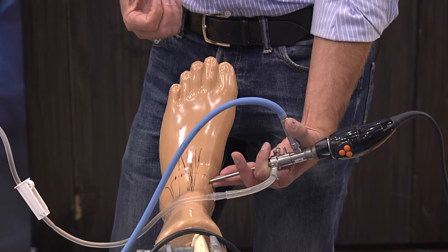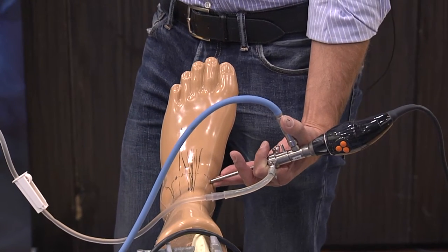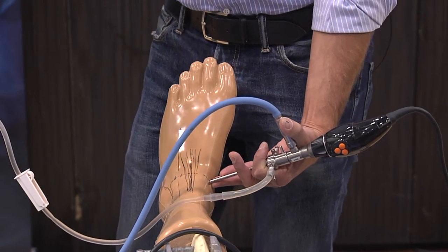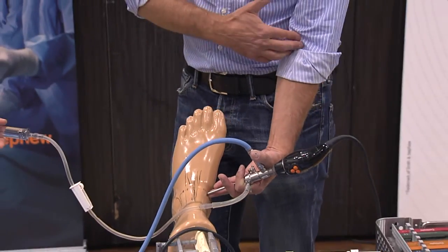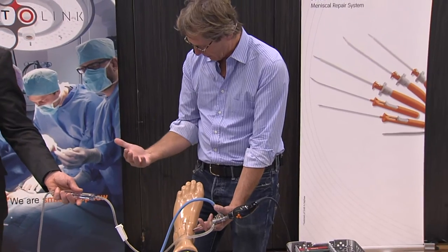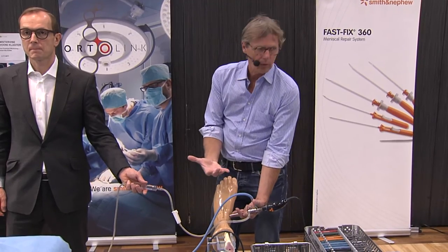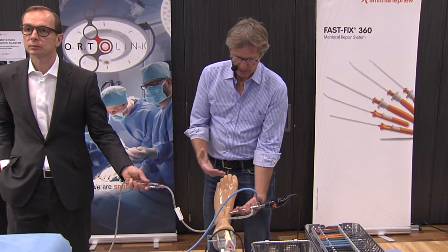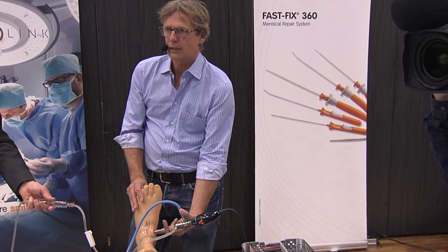In the courses I give, participants say their hands are too small, but I have size seven and a half, so there's no excuse. The trick is to put your elbow on your pelvis — then only the lower arm can move, which is much more stable. Put your elbow on your pelvis, give full supination of your hand. That's the way you hold it. If you get used to this grip, you will use it for all your scopes — in the knee, in the shoulder — it gives much more stability and control.